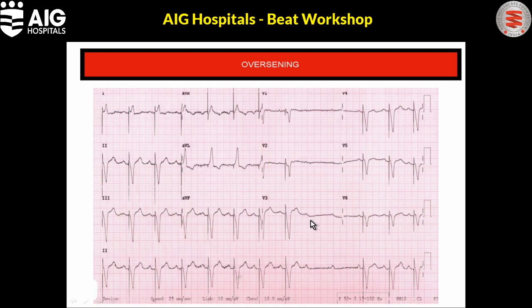Whenever this patient moves his hands, the fractured pacemaker leads, instead of sensing the native QRS complexes of the ventricle, have picked up the signals from the muscle. A pacemaker doesn't know how to differentiate whether these QRS complexes are due to cardiac or extracardiac sources. So after sensing an abnormal signal, the pacemaker decided to withhold the pacing stimulus. That is why you see a huge pause here. You see a P wave and the pacemaker has seen some abnormal impulses from the leads, so it has decided not to pace. This has led to syncope in this patient.